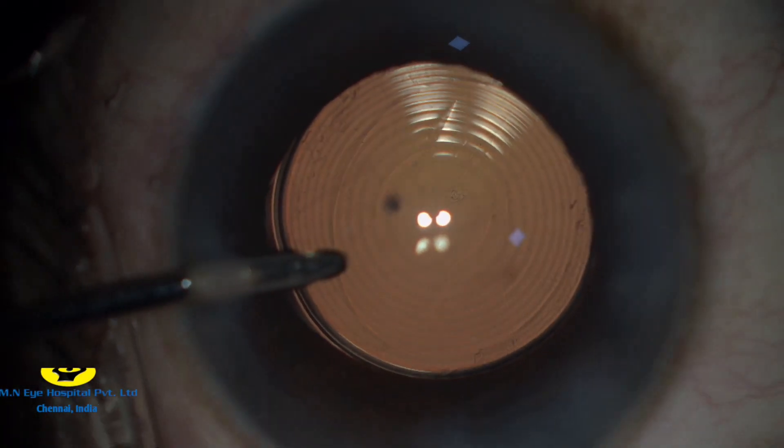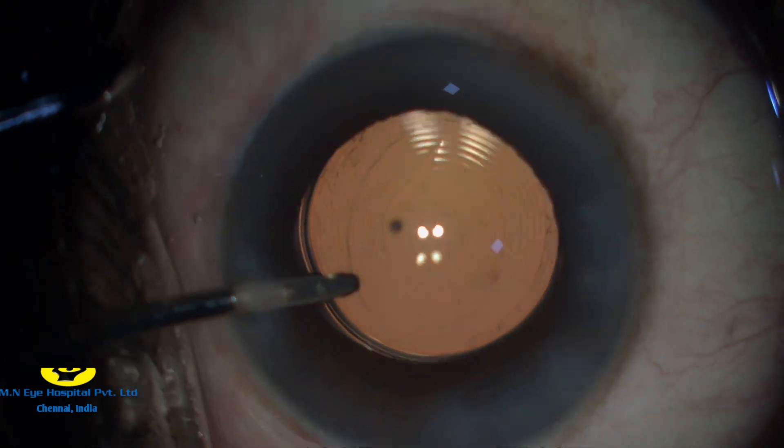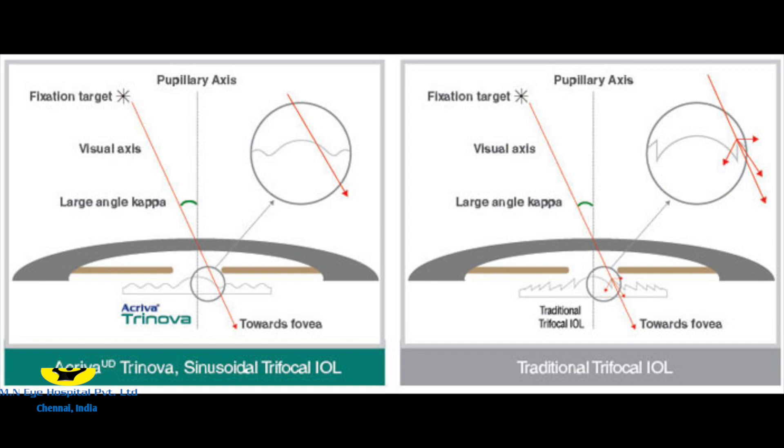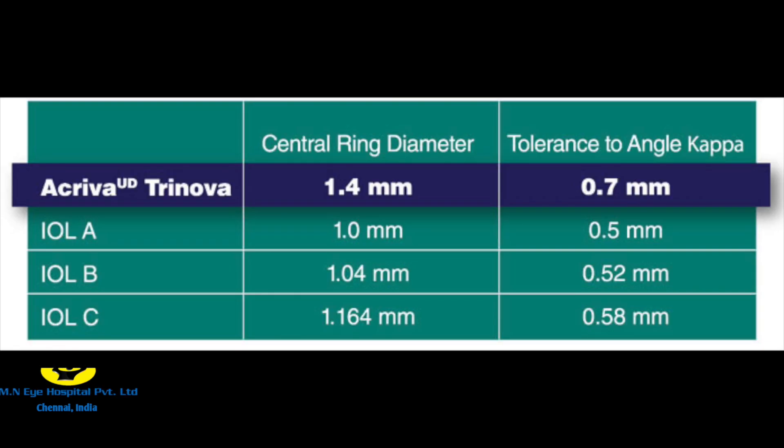A final wash of the anterior chamber is then done. Here, the size of the central ring plays an important role, as the wider central ring can tolerate a much larger angle kappa, therefore reducing the incidence of glare. The Acriver Trinova has a larger central ring diameter of 1.4 mm, which is much more than other trifocals, and therefore has a larger tolerance to angle kappa.